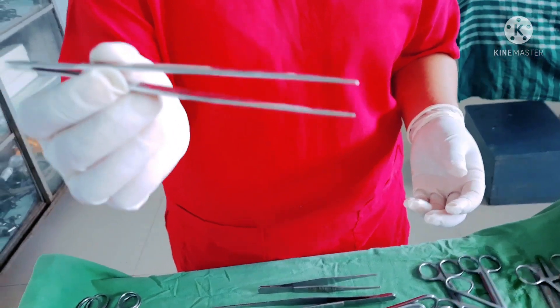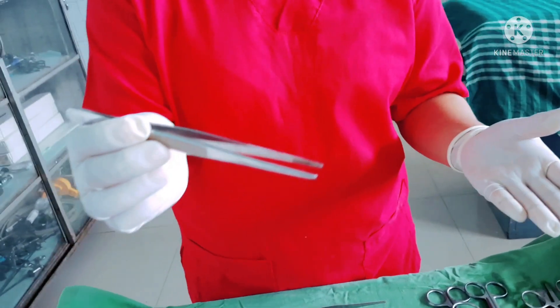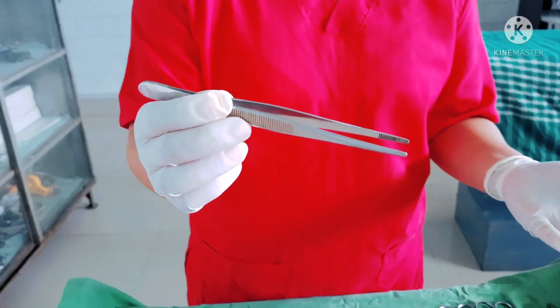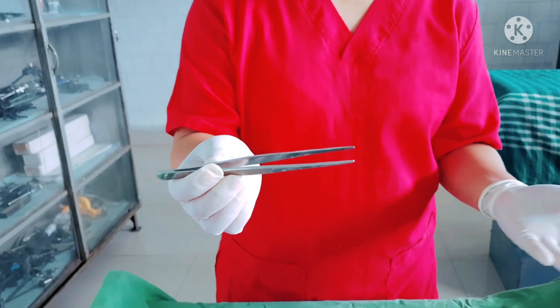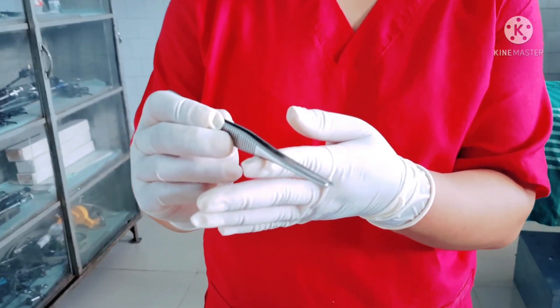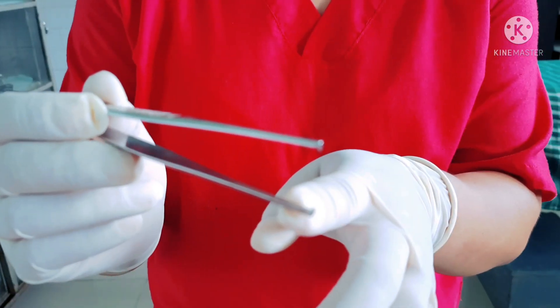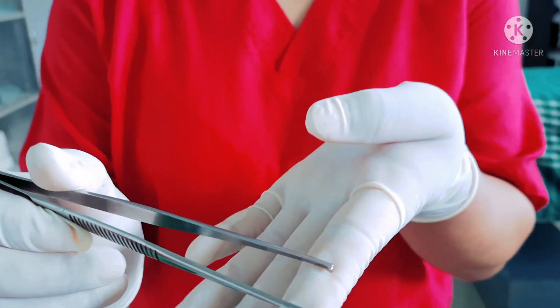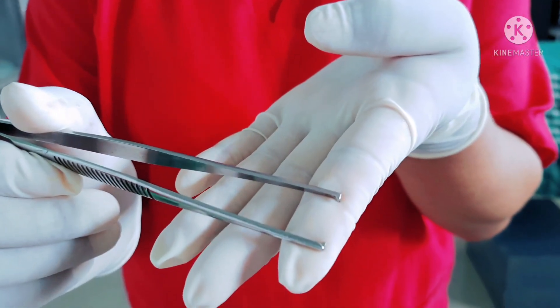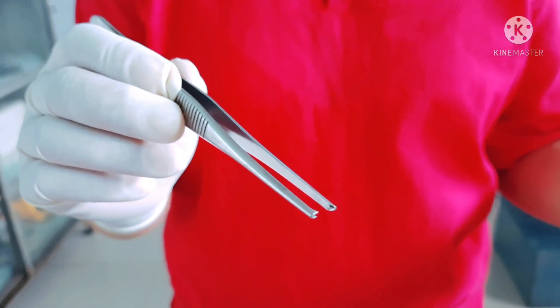This forceps is known as dressing forceps or plain thumb forceps, used mostly in soft tissues such as peritoneum structures. This forceps is known as toothed thumb forceps — it has a sharp tooth at the end and is used mostly for holding hard tissues, skin, and muscles, mostly used over the rectus sheath and skin suturing.